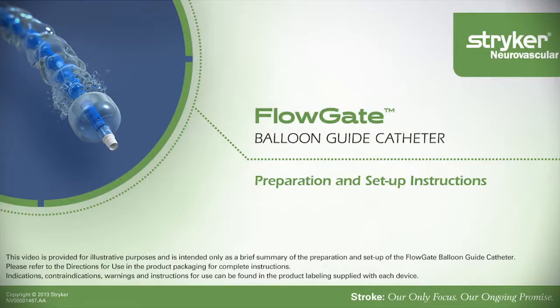This video is provided for illustrative purposes and is intended as a brief summary of the preparation and setup of the Balloon Guide catheter.